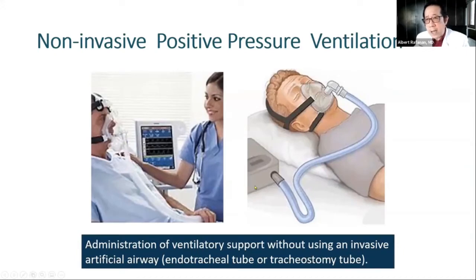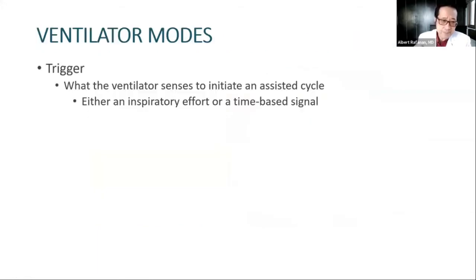Here it's just a regular BiPAP machine, which you can also use for our COPD patients or sometimes with congestive heart failure. In the COVID pandemic, I know this has been used in some centers, though some centers are more careful because of the aerosolization involved with this.